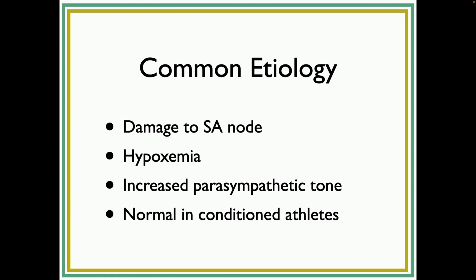Common etiology, why are people in sinus Brady? Damage to the SA node, hypoxemia, increased parasympathetic tone, normal and conditioned athletes. Okay? Okay, so those three are pretty easy, pretty straightforward. Normal sinus, sinus tach, sinus Brady.